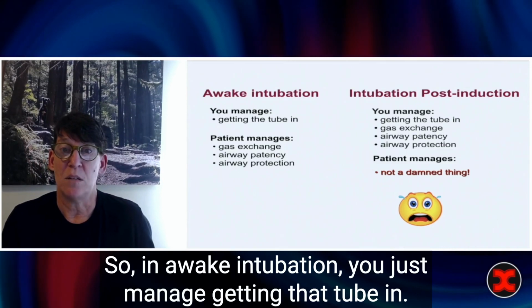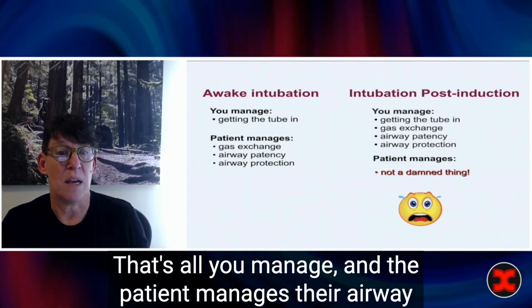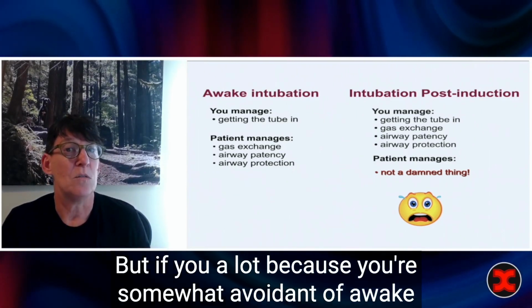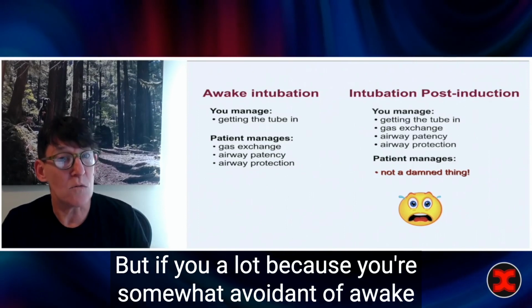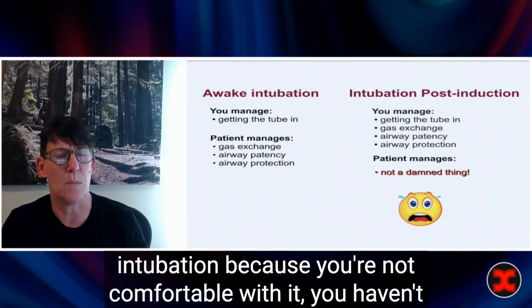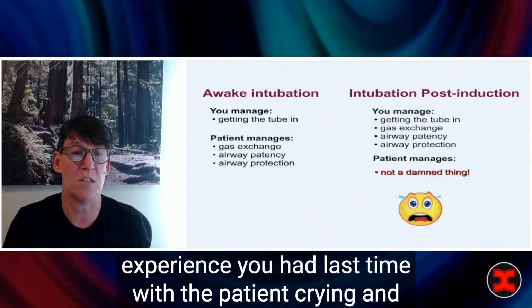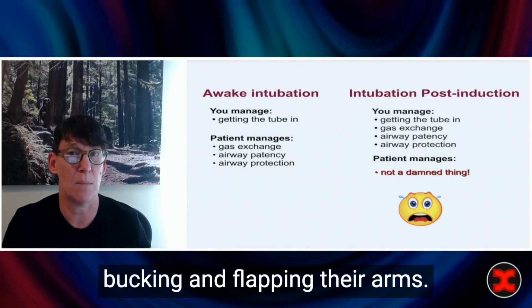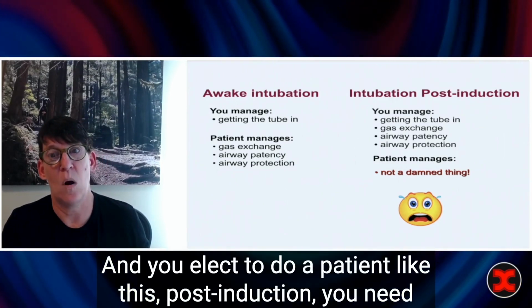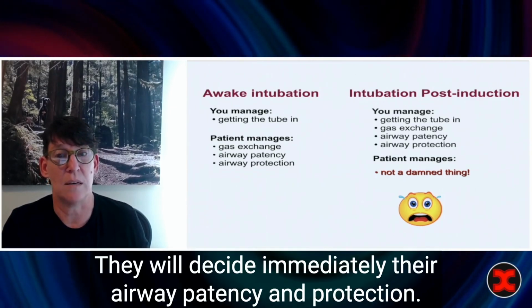So in awake intubation, you just manage getting that tube in. That's all you manage, and the patient manages their airway protection and gas exchange. But if you elect, because you're somewhat avoidant of awake intubation, because you're not comfortable with it, you haven't really done it before, or you don't want to have the same experience you had last time with the patient crying and bucking and flapping their arms, and you elect to do a patient like this post-induction, you need to manage their gas exchange. They will desat immediately.